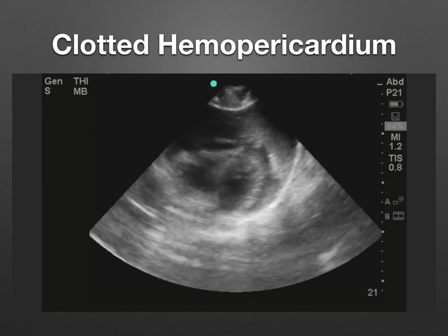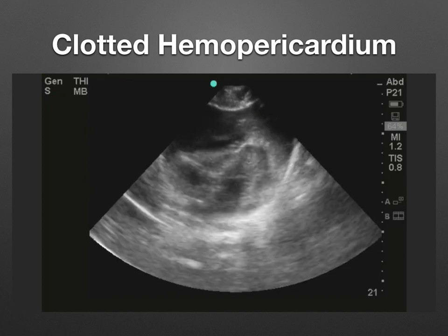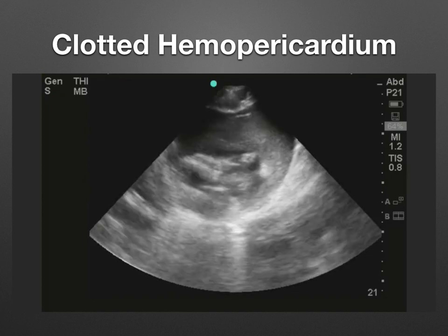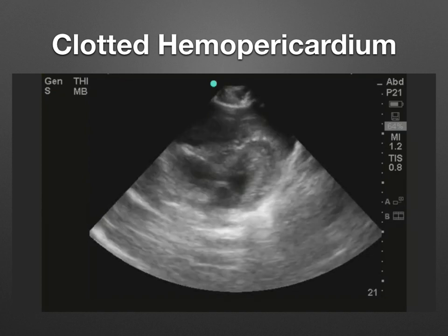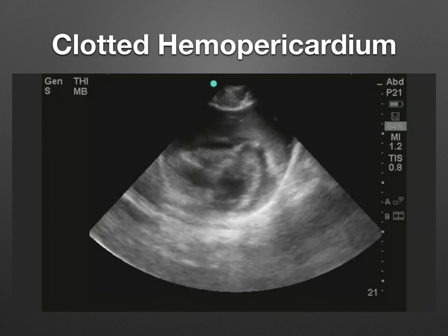This is an old echo of a patient that Dr. Boniface saw, I believe, and this was a patient that was actually shot in the chest, sent home, and returned later and found to have this clotted hemopericardium.